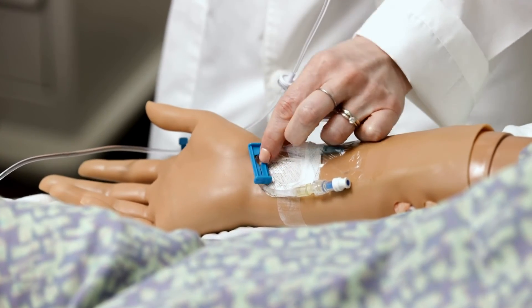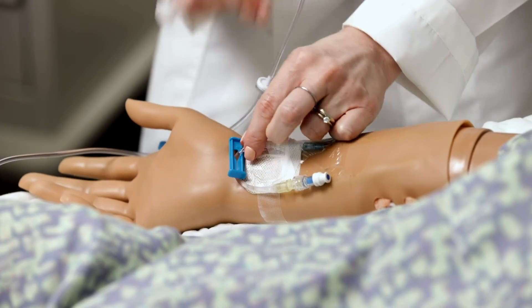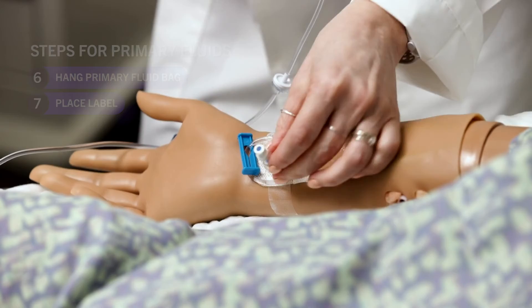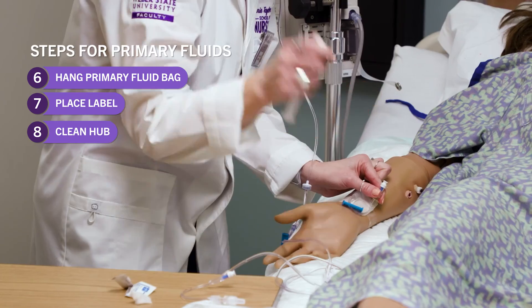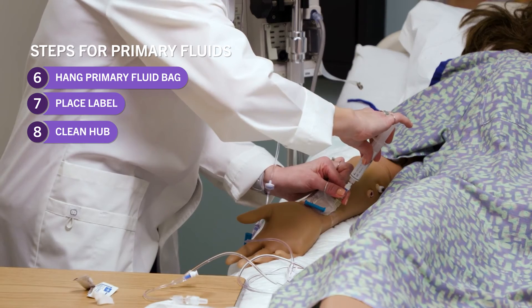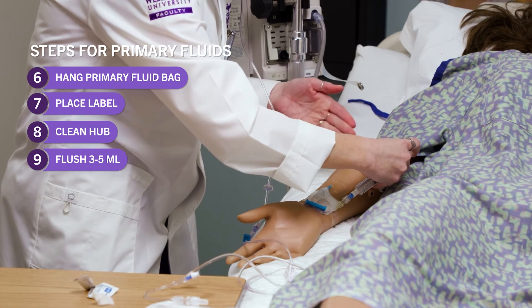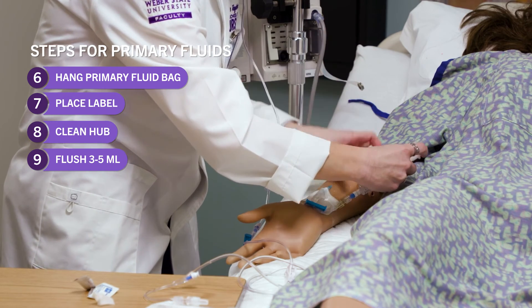Anytime we hook up IV fluids, we have to flush the line first so that we know it's patent. I'm going to make sure my clamp is unclamped — that happens a lot where you'll go to push and it's not going, because you've forgotten to unclamp. I'm going to get my hub and clean it for 15 to 30 seconds, then get my flush, pop the cap, and flush three to five mils. I'm going to make sure it's patent, it's flowing, the patient isn't complaining of any pain, and there's no swelling or infiltration.